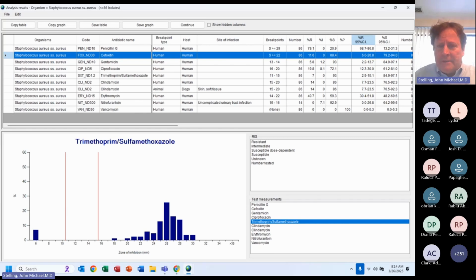A little bit of resistance can kill somebody with meningitis very quickly, but the person with pneumonia or an ear infection should probably be fine, because we can achieve much higher concentrations quickly when it's a blood infection or a surface infection than in meningitis. We have the blood-brain barrier, and the penicillin has to get through it. So we have meningitis and non-meningitis breakpoints because of the different clinical aspects.